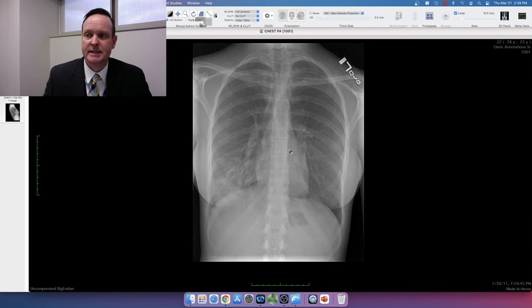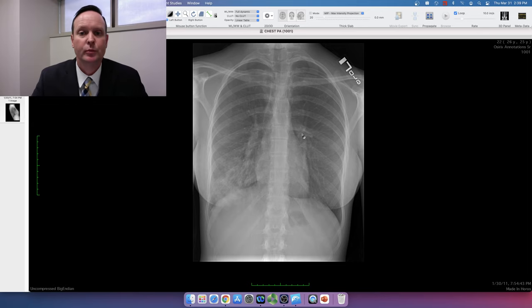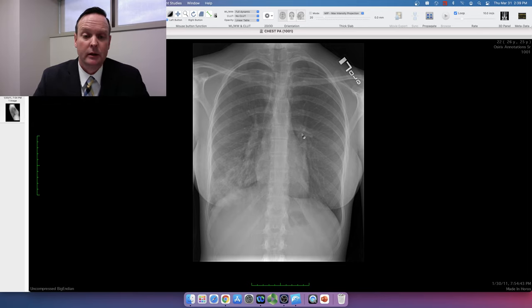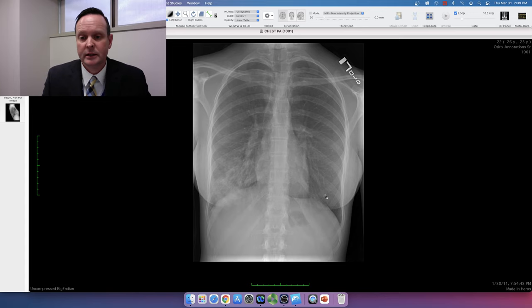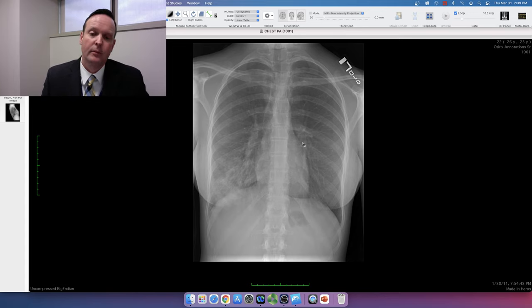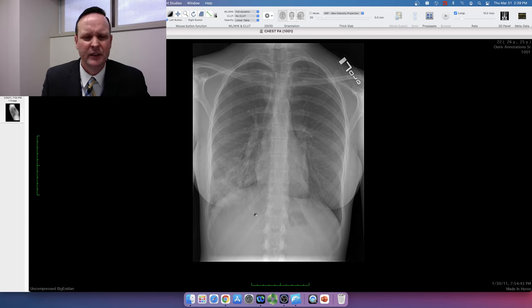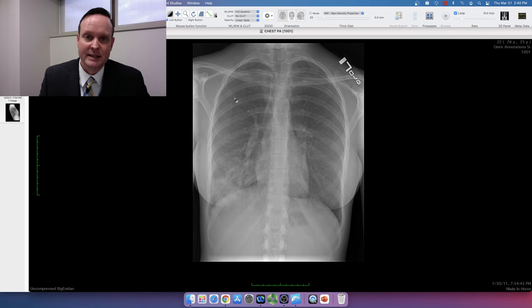The first case is a 25-year-old female who presents with a couple days of developing cough and fever. Looking at the chest radiograph, the left lung looks relatively normal, but on the right side, as we approach the right hemidiaphragm, we've got this poorly defined increased opacity. I am localizing it to the right lower thorax.